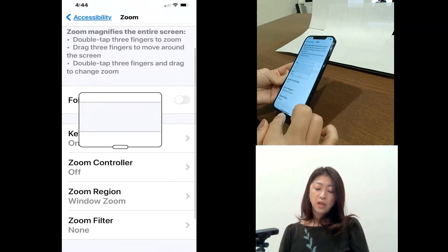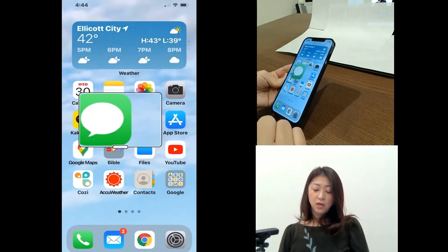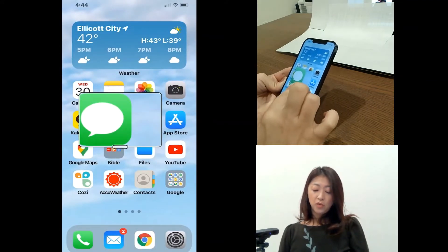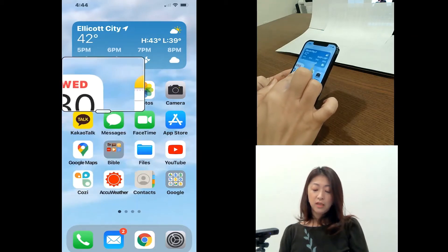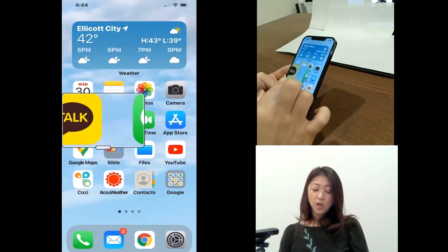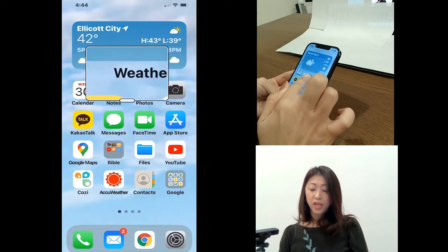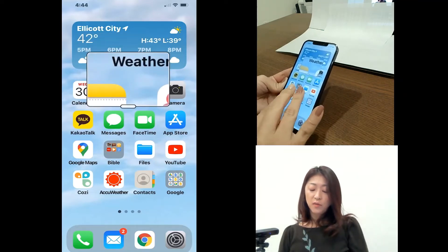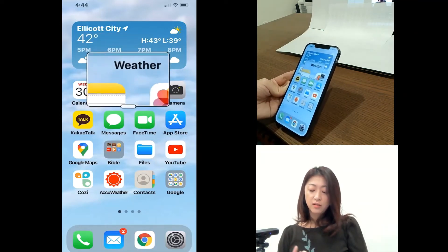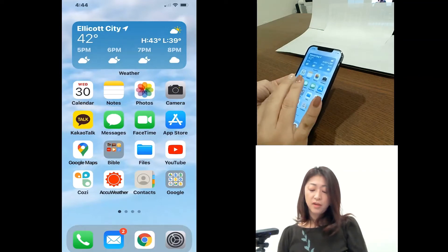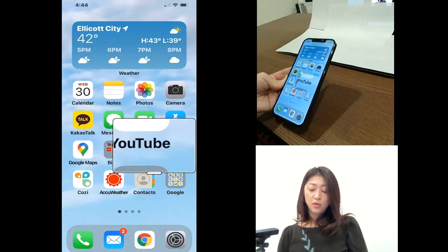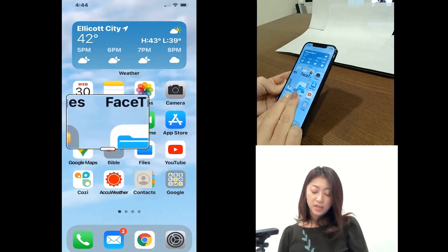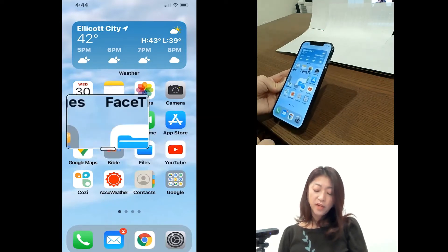So now let me go back to the home screen. And then I have this zoom window. Again, I can double tap with three fingers to turn it off. Again, to turn it on by double tapping with three fingers.